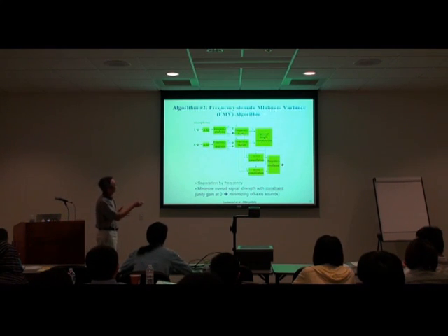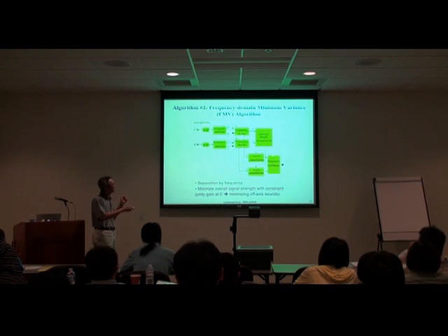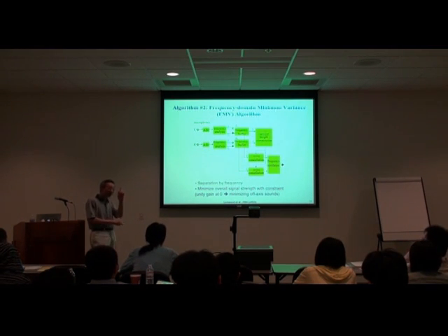This is why it is called minimum variance, because we're basically minimizing the output energy of the signal. It's very simple, optimal processing. Just weighting, and then we just reduce the energy of the output signal, but with the constraint that we have unity gain, maintaining the gain at one angle.